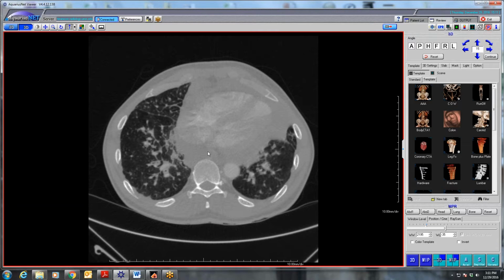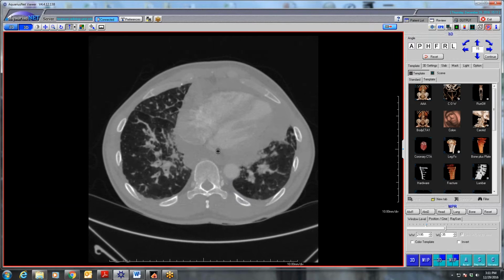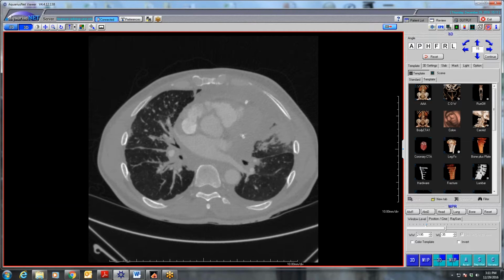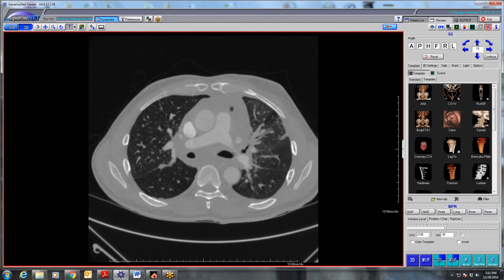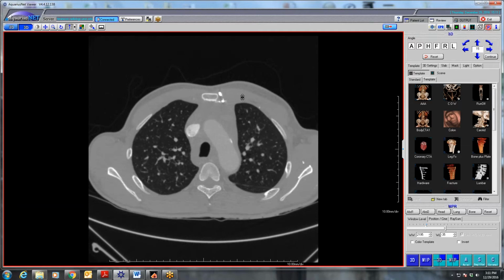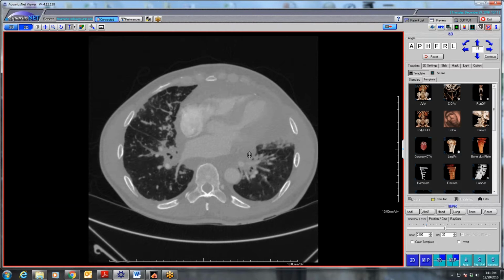There are two different ones. There's lymphangiectasia, which is the dilation of the intrapulmonary lymphatics, which often is fatal. And then there's lymphangiomatosis, which I think is what you're showing here. It's just all these lymphatic malformations. Yeah, we called it congenital lymphangiomatosis, but I'm never sure. I always get confused with these malformations. But bone lesions, right?